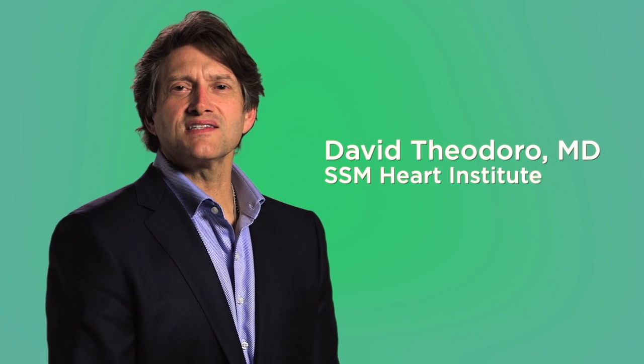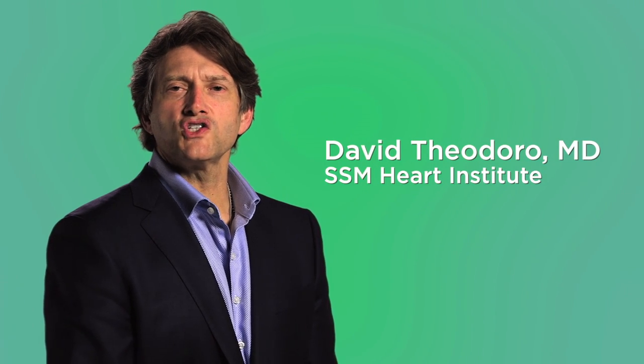Hi, I'm Dr. David Theodoro with SSM Heart Institute. I am pleased to share with you this informative animation about how we can repair your atrial septal defect minimally invasively using the DaVinci robot.